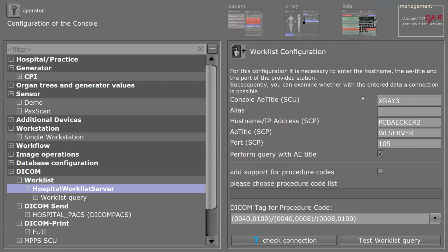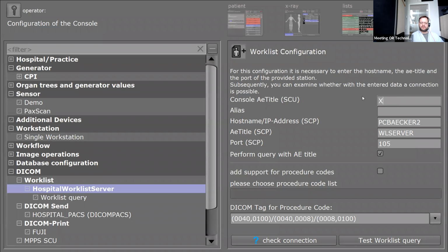If the hospital asks they need your AE title, port, and address of our DICOM director, to add the license, you can ask support. Sure. Yeah, okay. Sure.